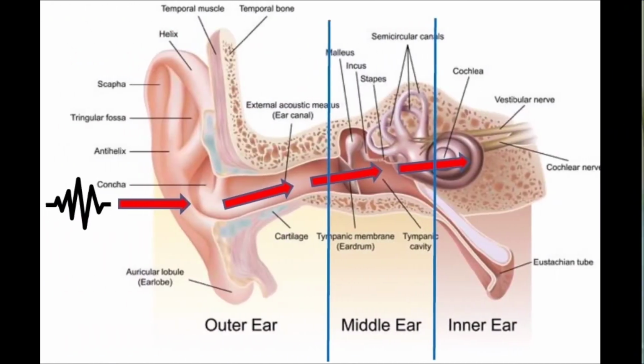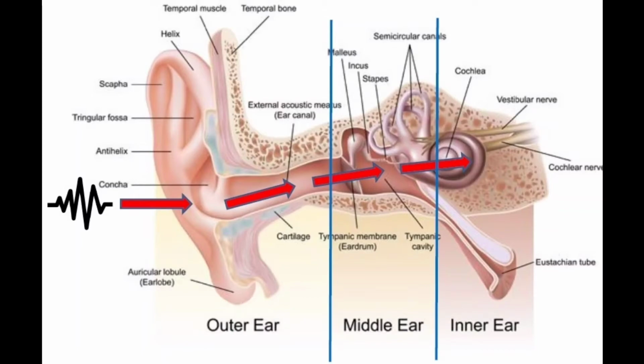Okay, headphone is used to measure the entire hearing mechanism from outer ear, middle ear and inner ear. This is an ear mechanism picture. Headphone is used to analyze hearing loss level. When the assistant gives the tone, the subject will press the button when they hear the tone sound. Headphone is used to examine the left and right ear.